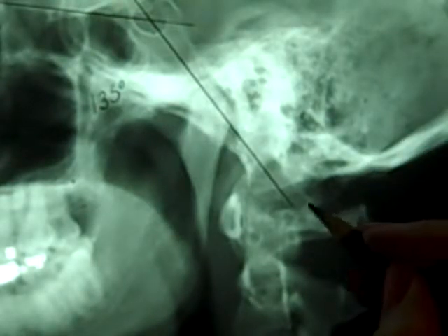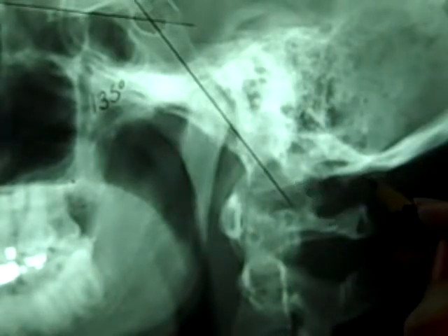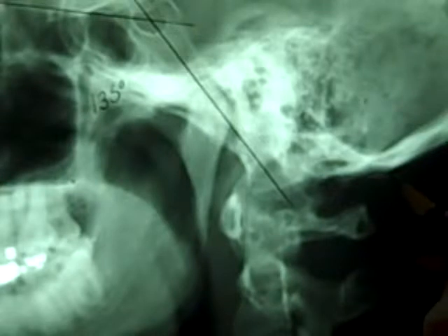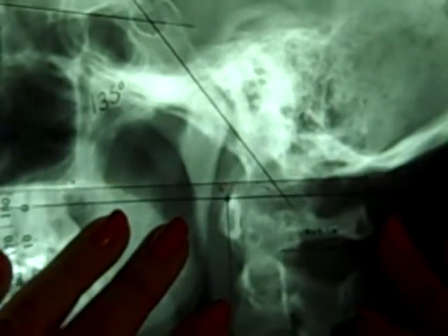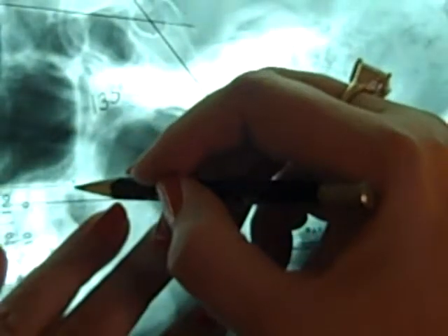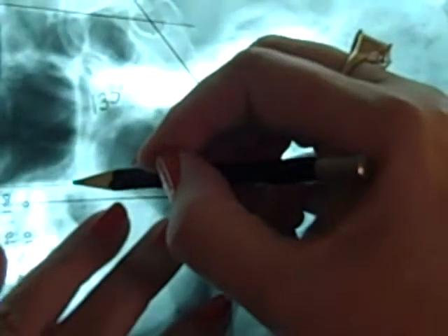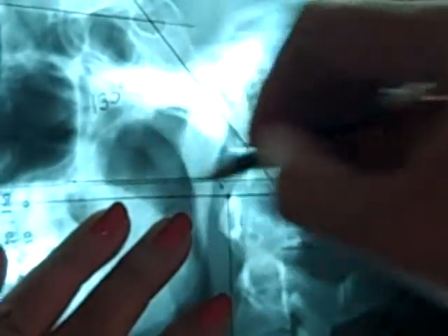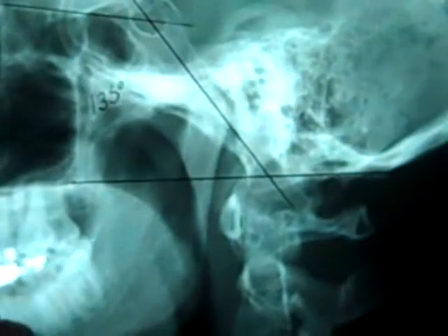Now we do have a mastoid process coming down right here, so don't take off on the mastoid. We are using the floor of the skull or the base of the occiput, and the lowest point I think would be about right there. So I'll line my protractor up with those 2 points, and I will draw a line across right there.